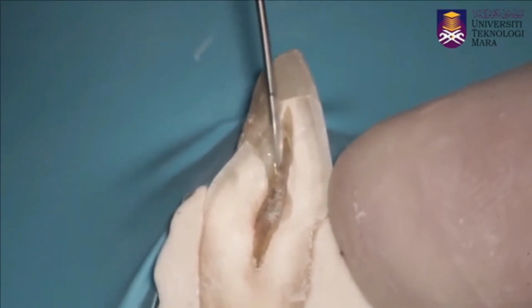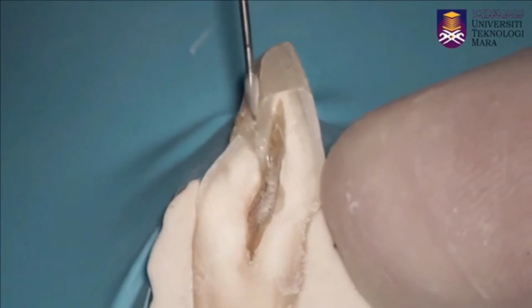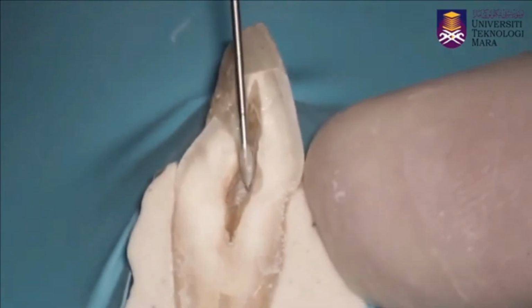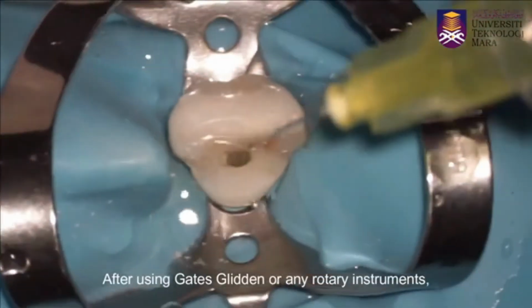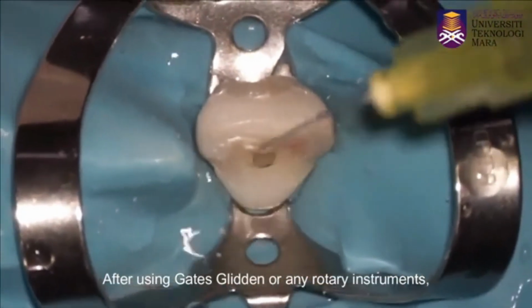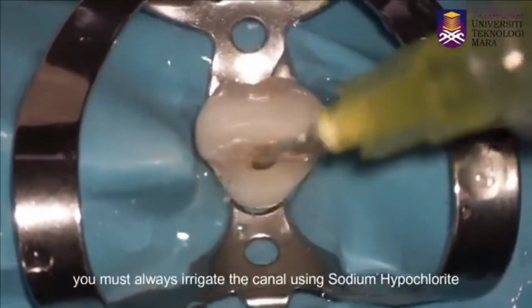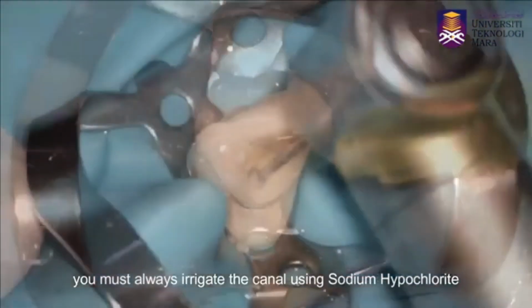The lingual shoulder is a prominence of dentine formed by removal of the lingual roof that extends from the cingulum to 2 mm apical to the orifice. During removal of the lingual shoulder, the orifice should be flared. By this, a straight line access to the apical foramen is obtained.